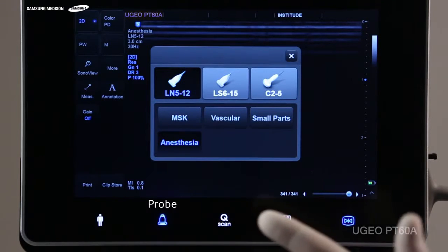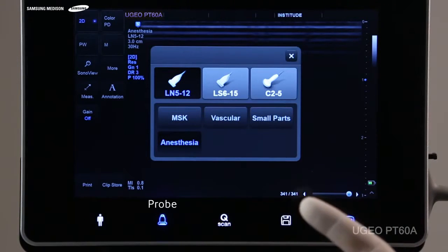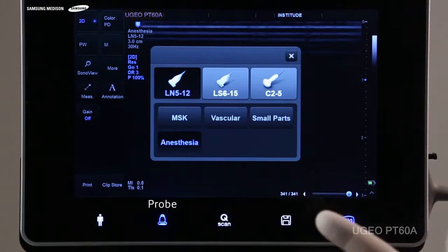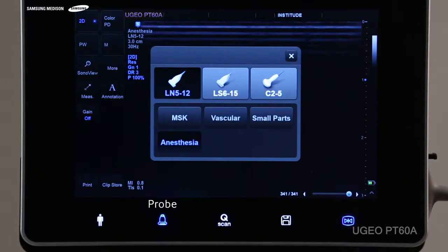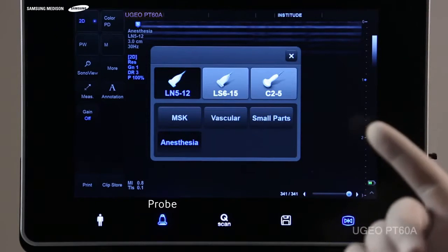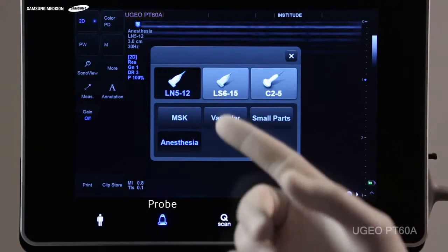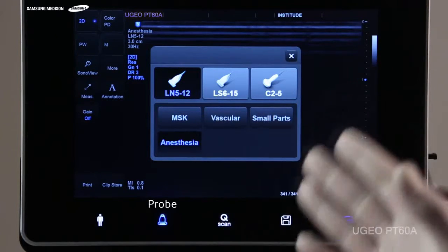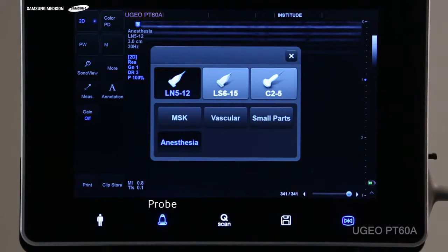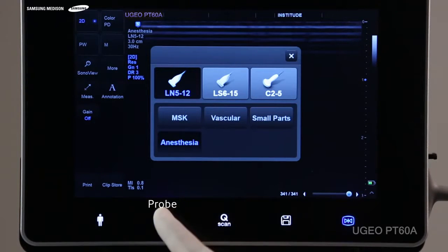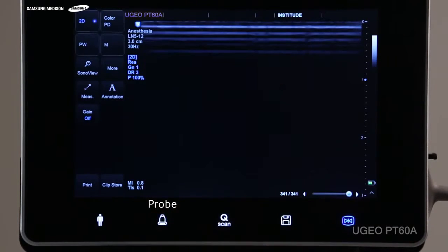Next, you can select the application of your scan, such as anesthesia, musculoskeletal, vascular or small parts. By pressing again on this transducer key, the selection options are gone from the screen.